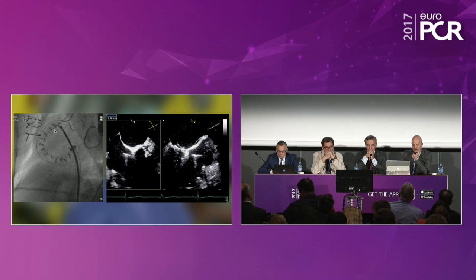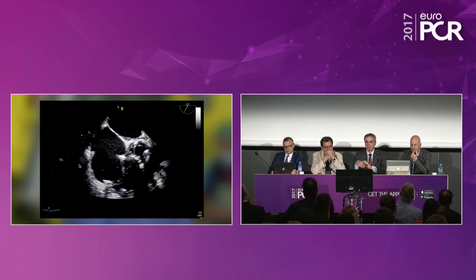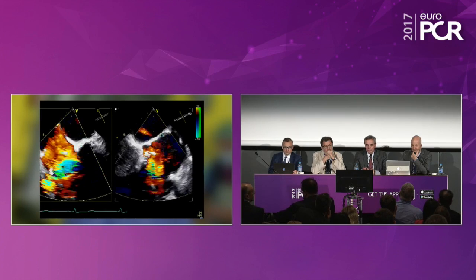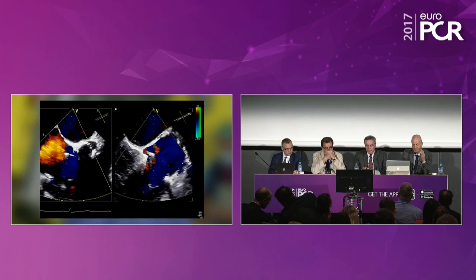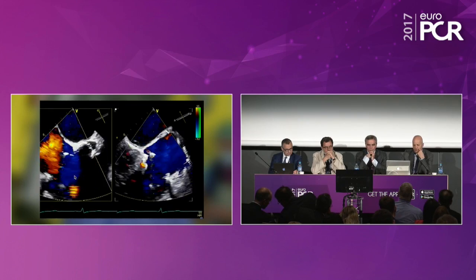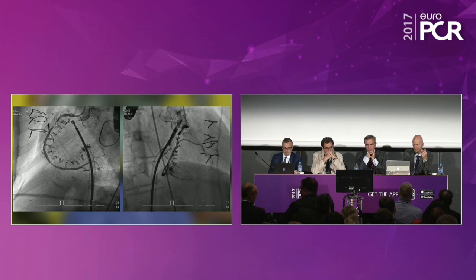This is a baseline situation, no cinching, all anchors implanted. And then you have to do quite a bit of measurements. And here you can see the distance. It's 41 millimeters, and severe tricuspid regurgitation, once all anchors are in place but no cinching has taken place. And then you start the cinching process. You foreshorten up front by 2.5 centimeters. And here you can see the usual thing.